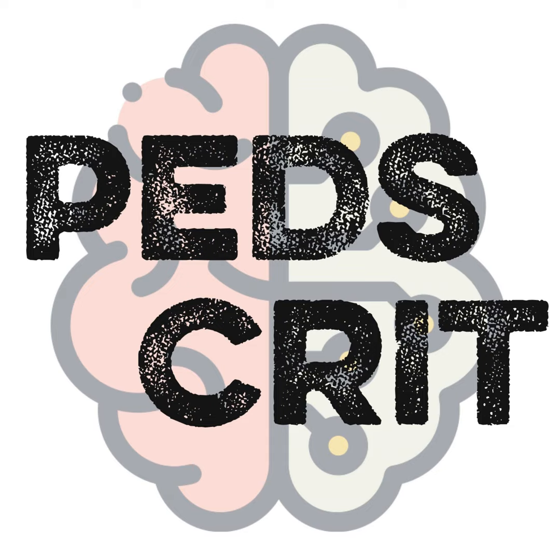Understood. Something I expected you to say, that I'm sure there was a great reason you didn't, is that you didn't mention anything about titrating the power or the amplitude for what you clinically see, chest movement. The wiggle, yeah. Tell us more about why you think that's not necessarily helpful. Well, the wiggle is really fascinating because everybody wants to look at the wiggle. I think of the wiggle as somewhat binary. So it's absent or it's not absent. And I don't really see a strong correlation between the amount of chest wiggle, whether or not it goes up to the umbilicus or up to the groin, and lung aeration or sufficient ventilation.